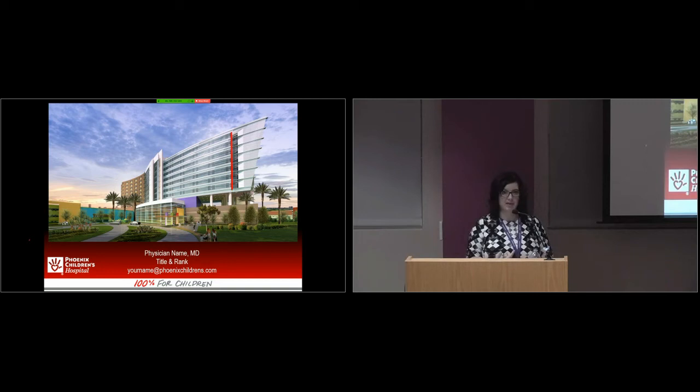The other thing is for some of the cardiac cases, depending upon what it is, when we first place a line, we will place it higher in the right atrium to allow for the CTA, the cardiac CT, and then we'll pull the line back a little bit to the diaphragm, and it just allows for better imaging for cardiac CT. But a power PICC should be chosen, one, when you need to do repeat CTs or even think you're going to do a repeat CT.